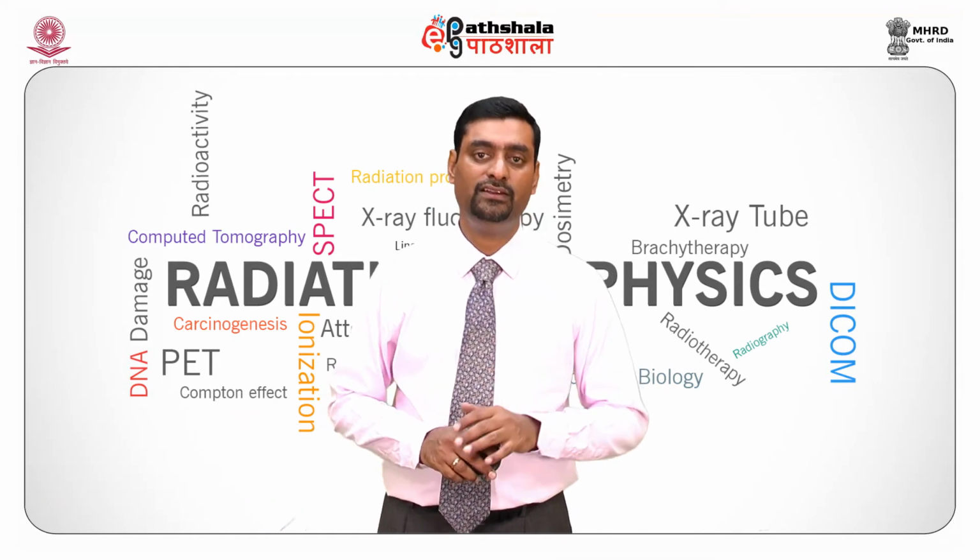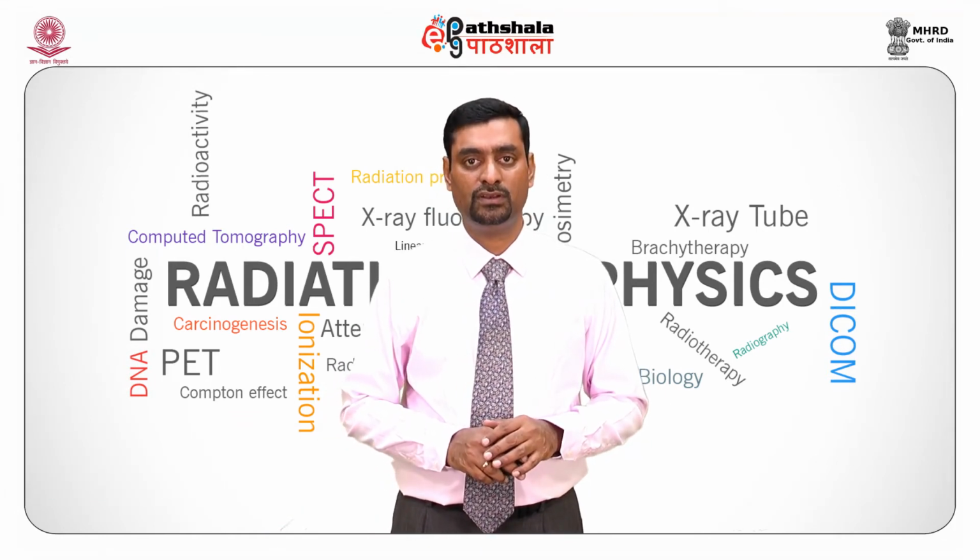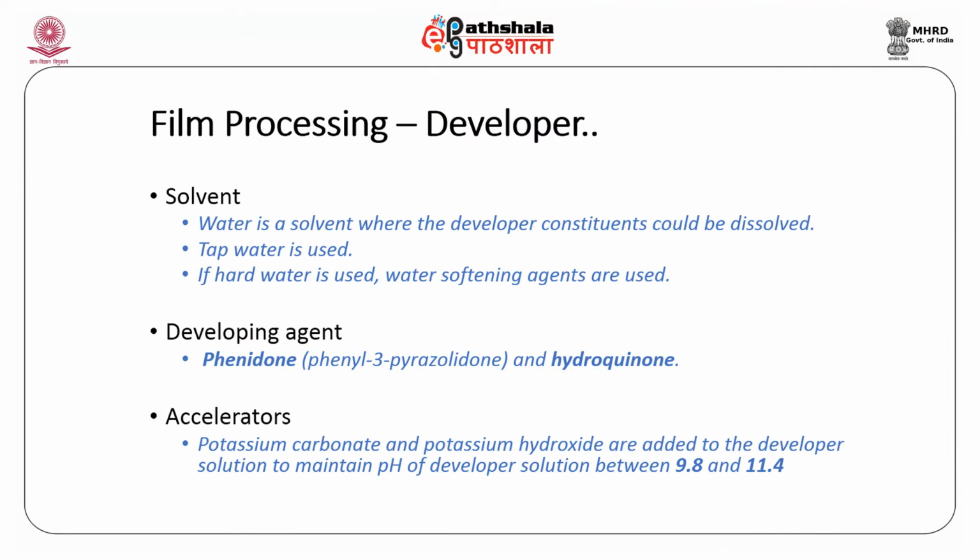Let us see the ingredients of a developer. It requires a solvent. Water is a solvent where developer constituents can be dissolved. Generally tap water can be used. If the water is hard, water softening agents can be used. The main ingredient in a developer is a developing agent. Phenidone, phenyl 3 pyrazolidone and hydroquinone are used as developing agents.